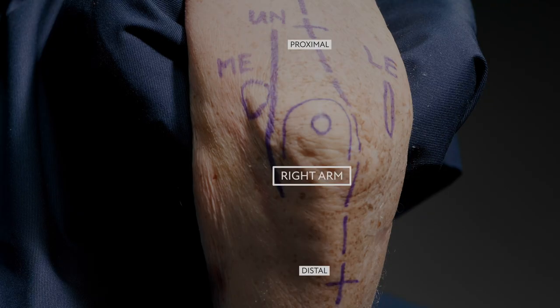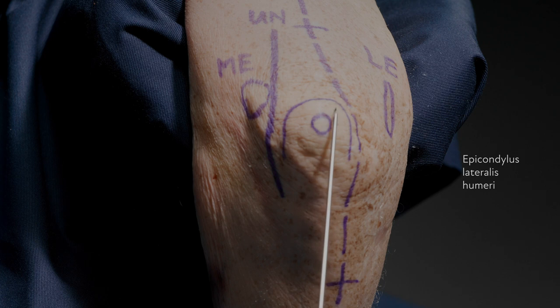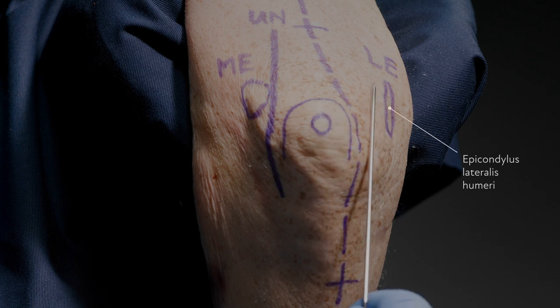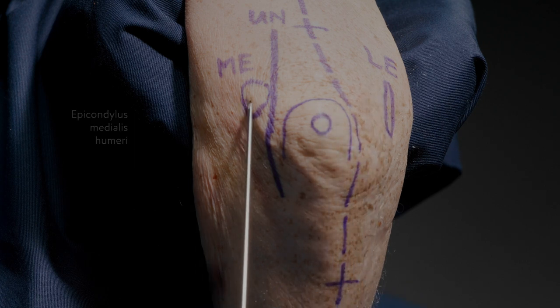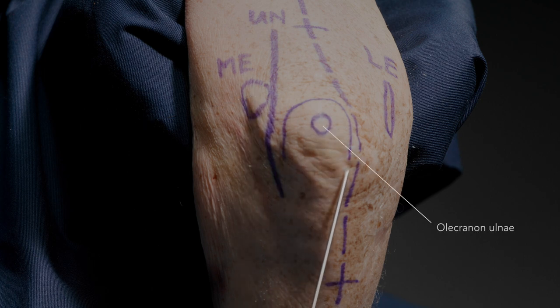Trans-olecranin approach to the distal humerus. The lateral epicondyle, the medial epicondyle, and the tip of the olecranon with the topography of the olecranon marked out.